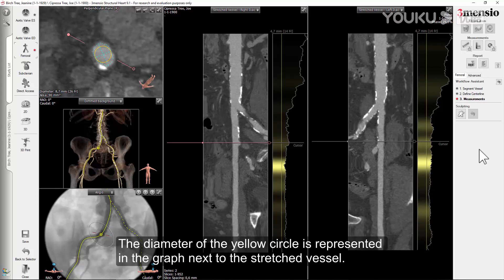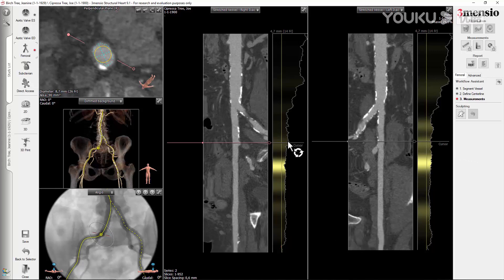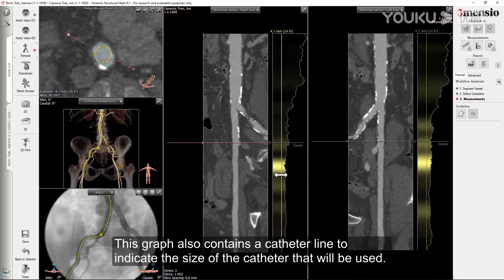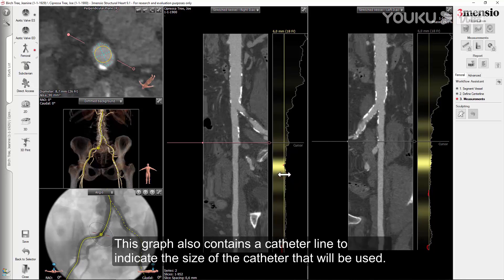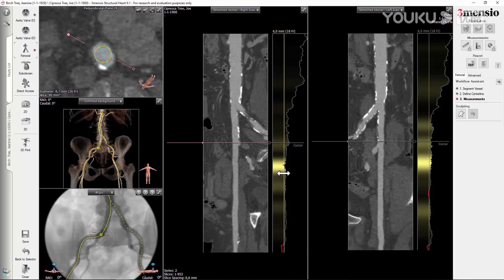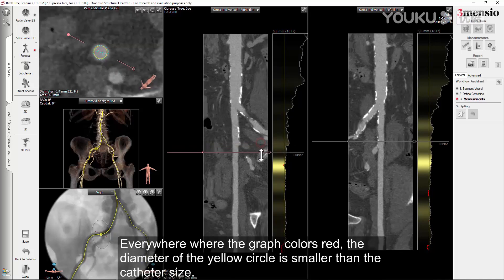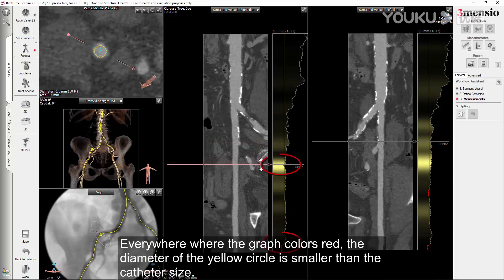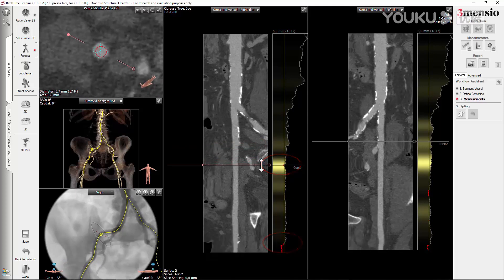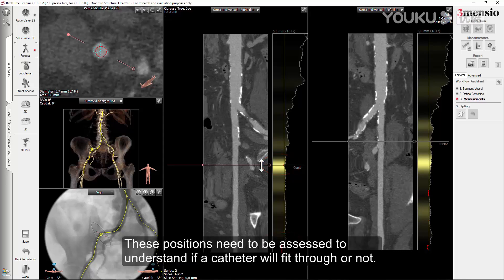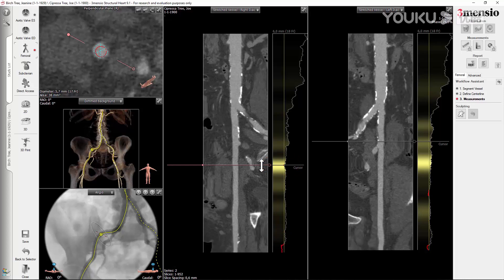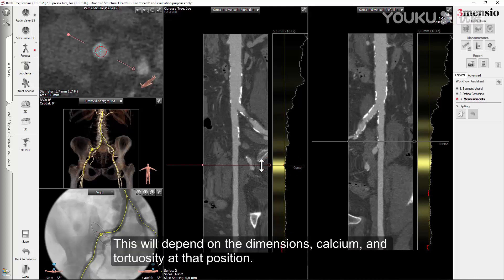The yellow circle mimics a catheter. The diameter of the yellow circle is represented in the graph next to the stretch vessel. This graph also contains a catheter line to indicate the size of the catheter that will be used. Everywhere where the graph colors red, the diameter of the yellow circle is smaller than the catheter size. These positions need to be assessed to understand if a catheter will fit through or not, depending on the dimensions, calcium, and tortuosity at that position.